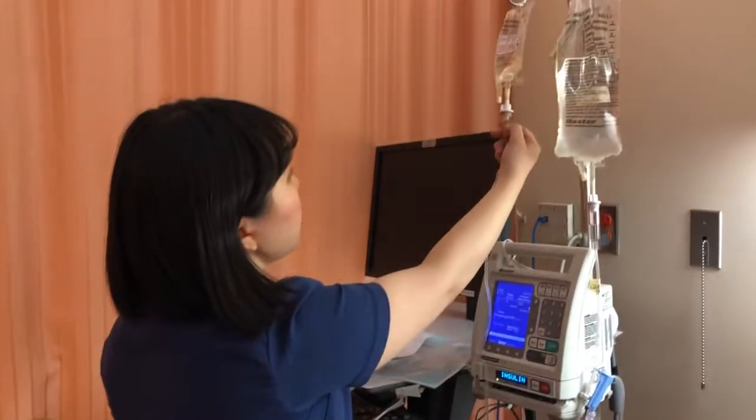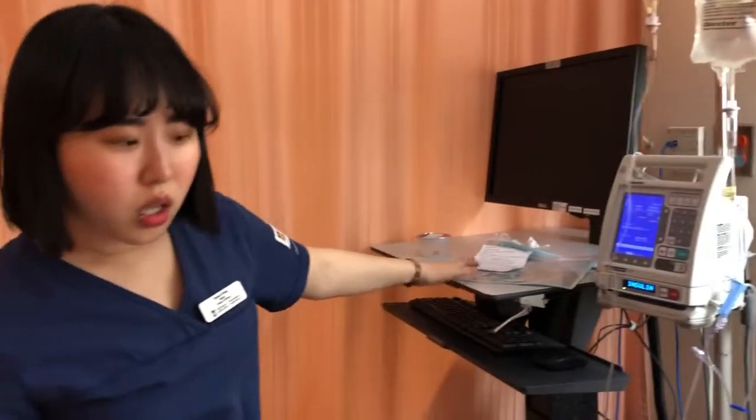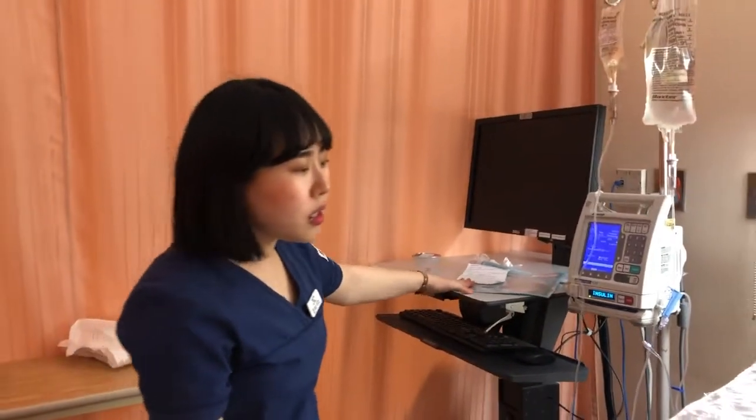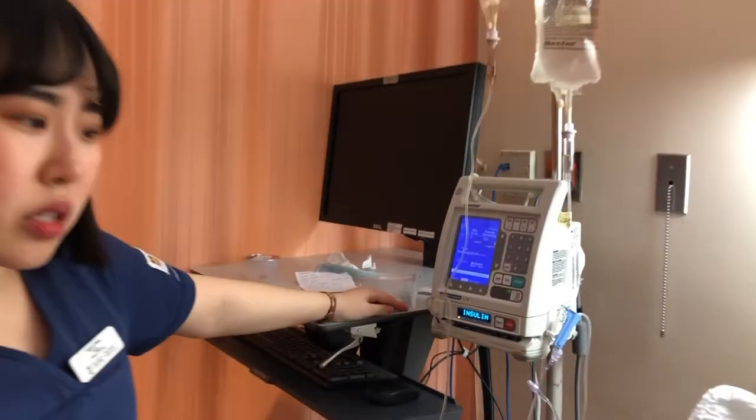So I'm also checking the 3 drops here, 1, 2, 3. So it's going well. Just rub it with an alcohol swab. And I'm going to evaluate after when I come back.